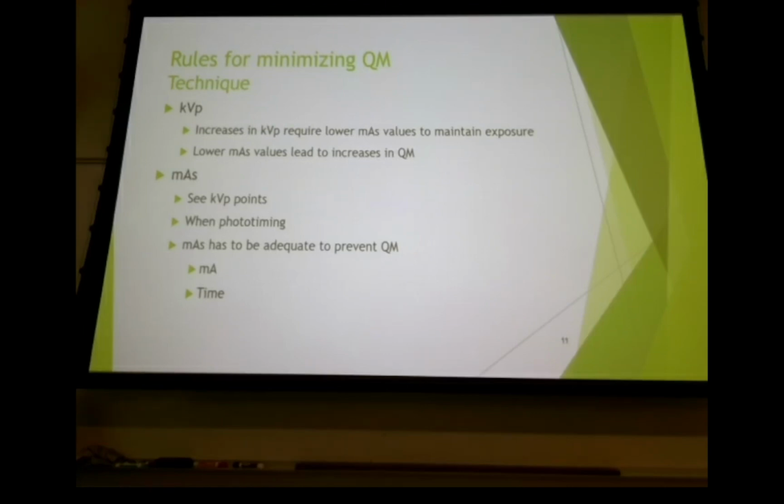Distance. A distance could be beneficial, yes. As we increase our distance, our options are to increase kVp or increase mAs. Increased mAs, we've got more heat generated, right? But what else? It doesn't really do anything on the image. You can shoot a chest X-ray with 80 kVp all day long, and as long as you're processing it under a chest X-ray algorithm, that's what it's going to look like, a chest X-ray, right? Or you could shoot ribs with 110 kVp, and as long as you're processing under ribs, what's it going to look like?